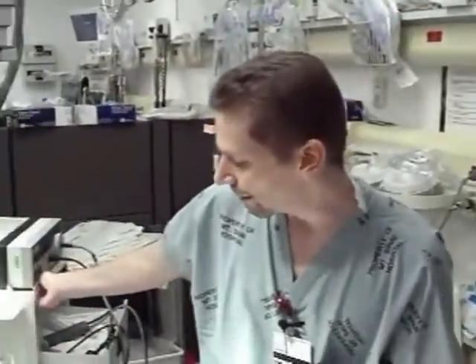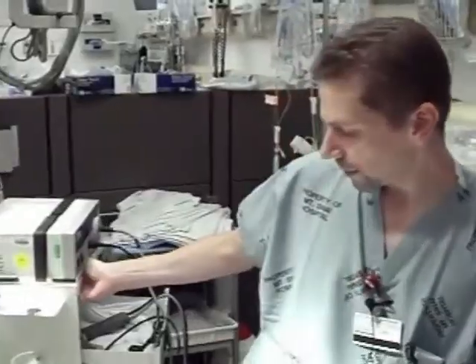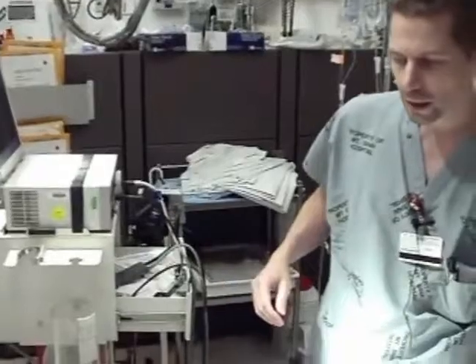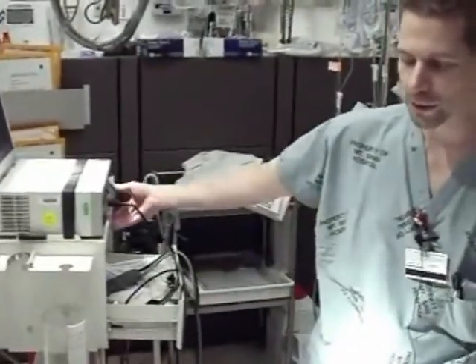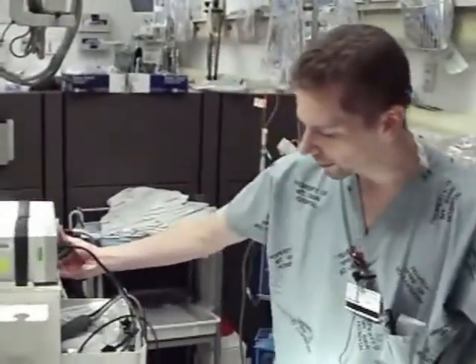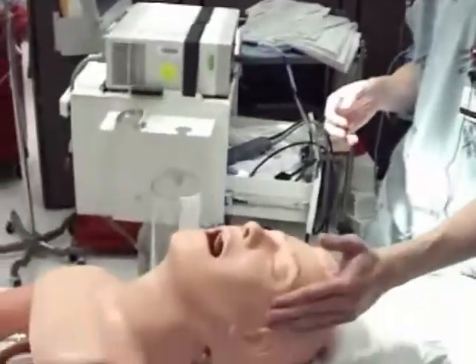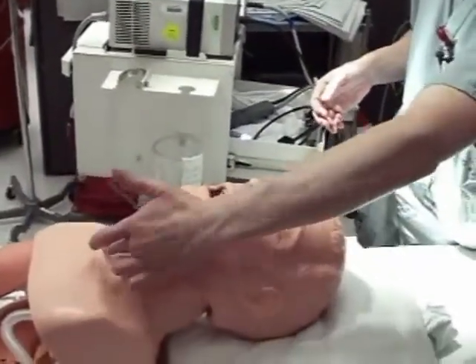Now you're actually ready to try laryngoscopy. I'm always going to talk about everything from the cognitive perspective, and when you're in the midst of a difficult procedure, it's easy to lose sight of the individual steps. So I like to talk about having a goal for each step of laryngoscopy — if you've accomplished the goal, only then do you move on to the next step. The first step is proper positioning, and our goal is to have the ear hole on the same line as the sternal notch.